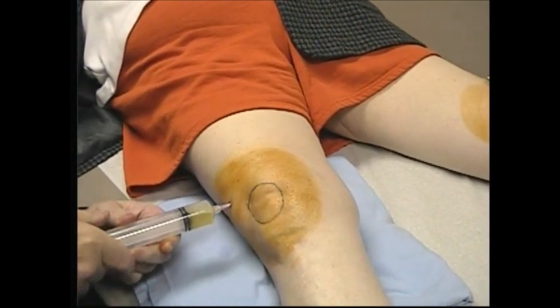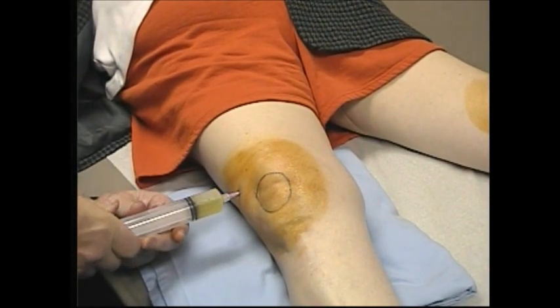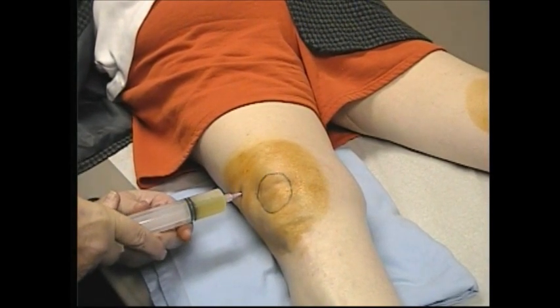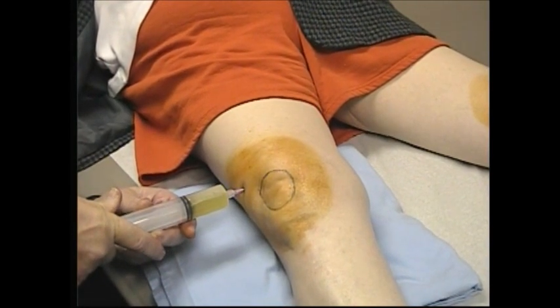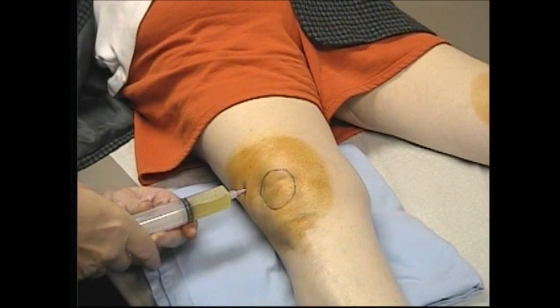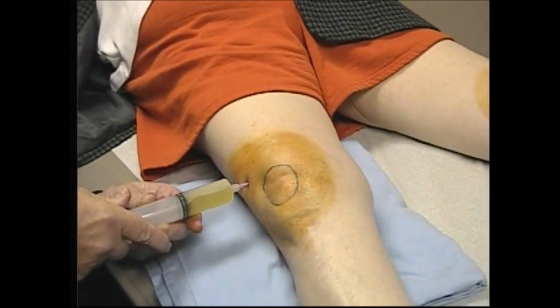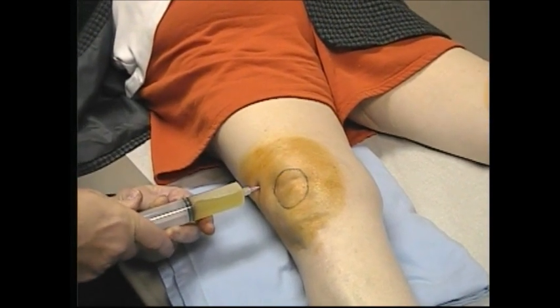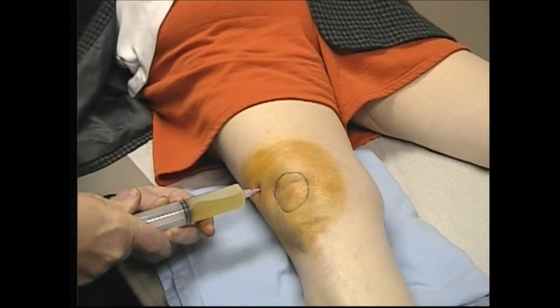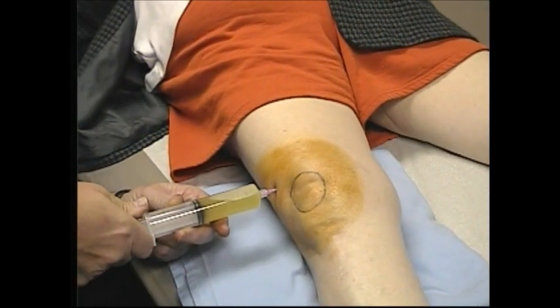My assistant wears gloves so there's no contact with the bodily fluids. What you do here is just keep gentle pressure. If you use too much pressure, the synovium will come into the edge of the 18-gauge needle and stop flowing. If it does, a little trick to get it flowing again is to take the syringe off the needle and allow the fluid to just flow through the needle and into a basin.